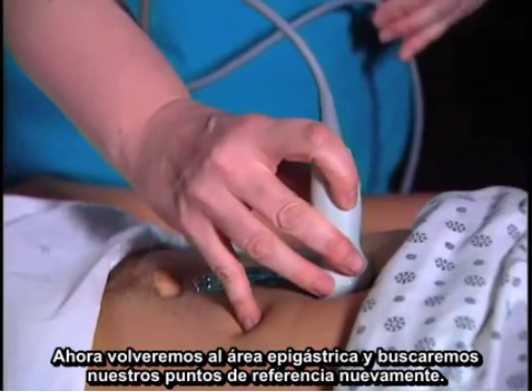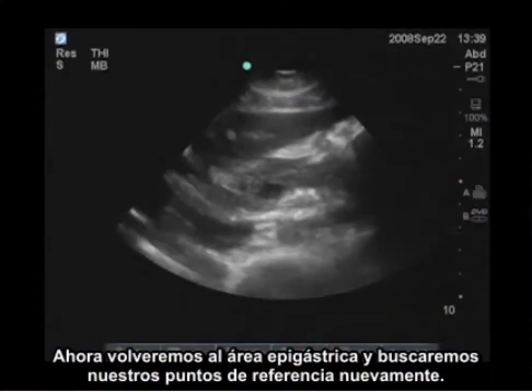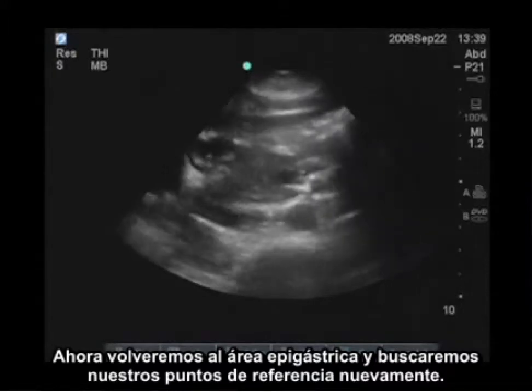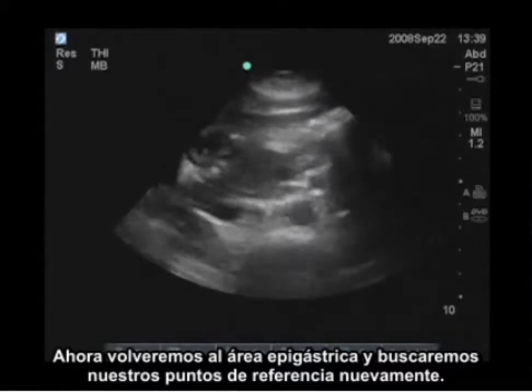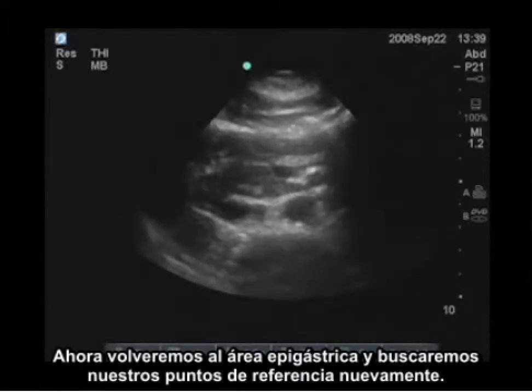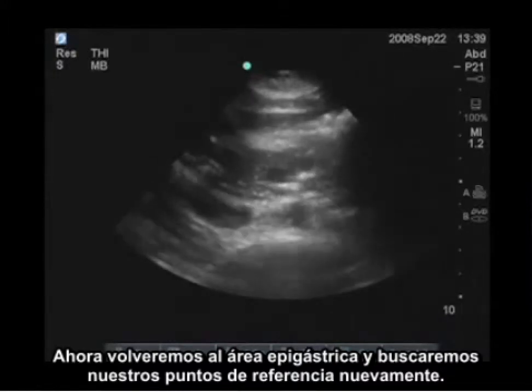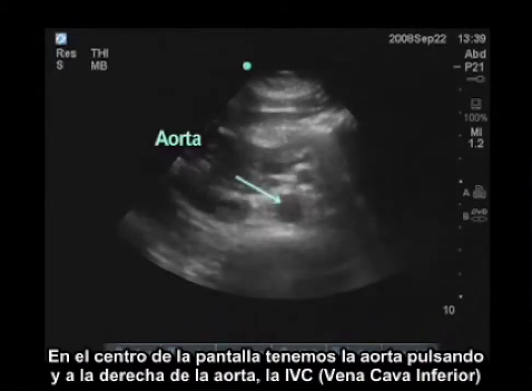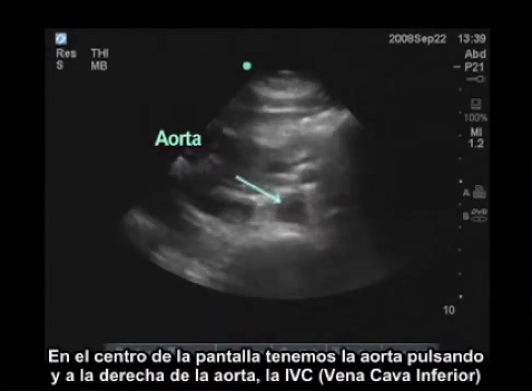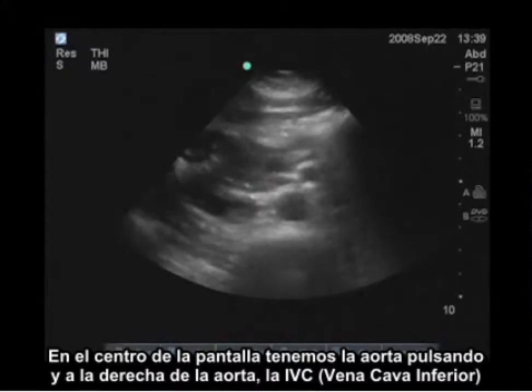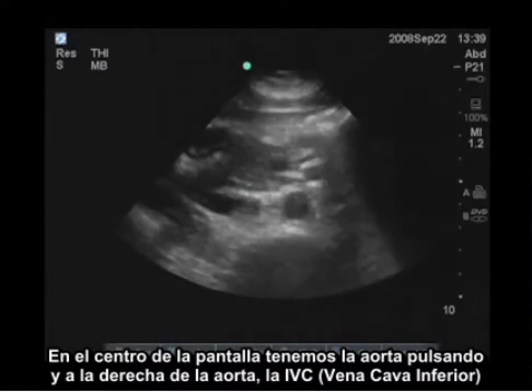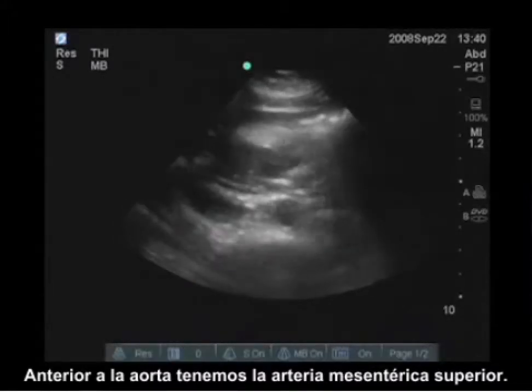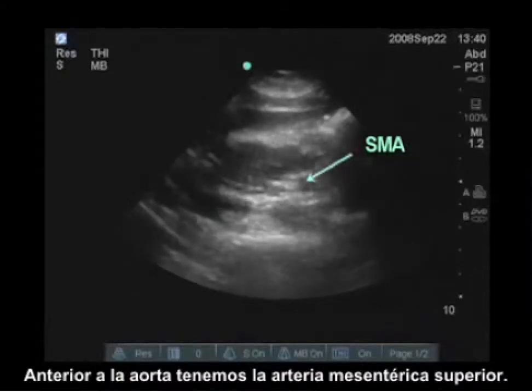We're going to go back to the epigastric area and look for our landmarks again. In the middle of the screen, we have the aorta pulsating. To the right of the aorta, the IVC, and anterior to the aorta, we have the superior mesenteric artery.